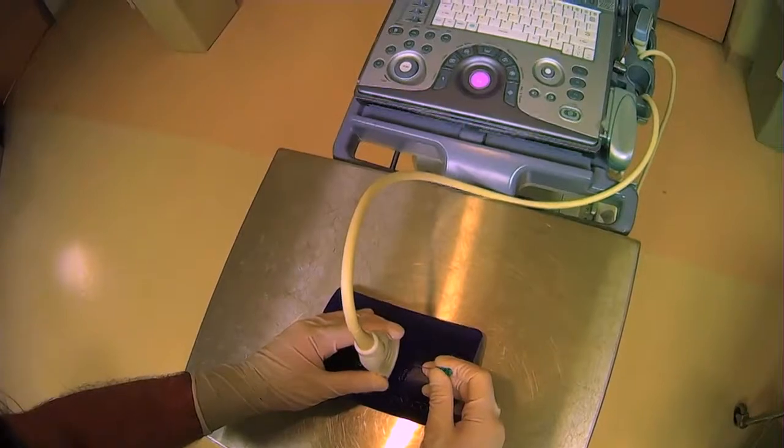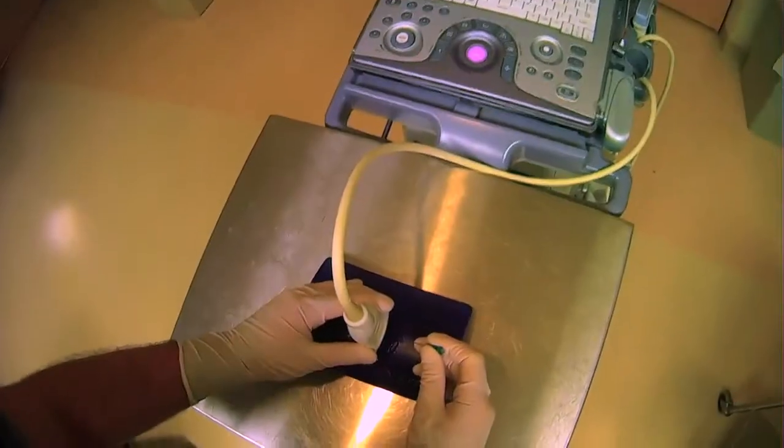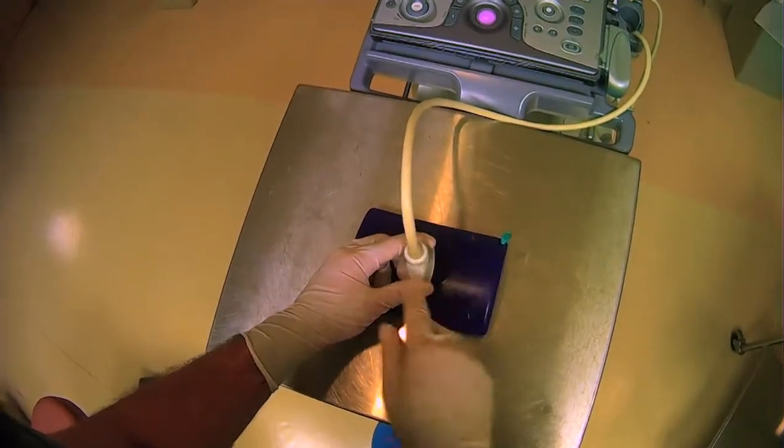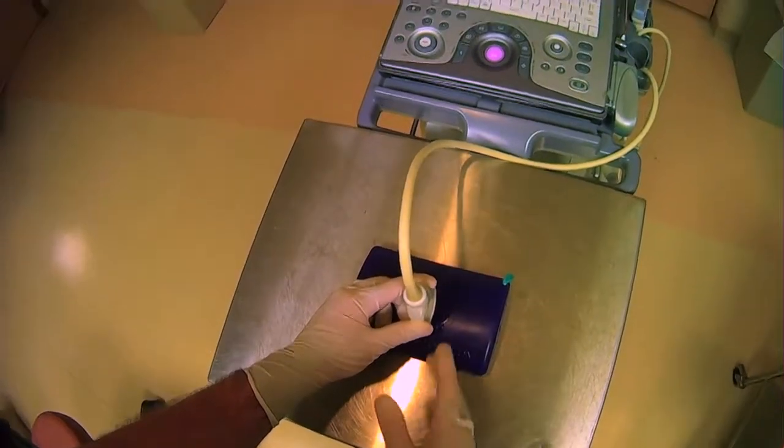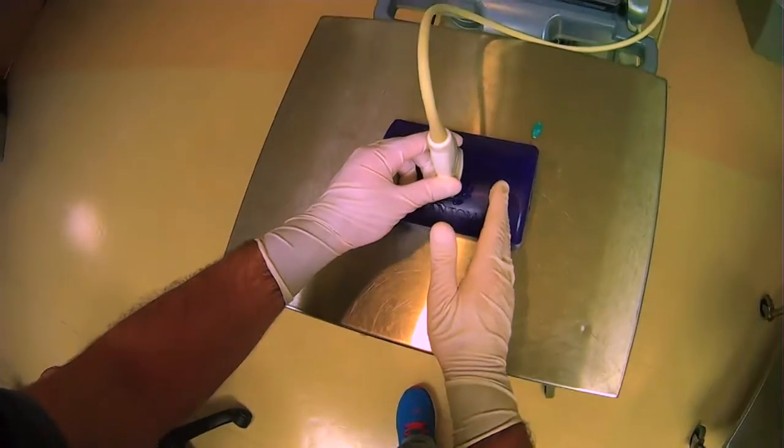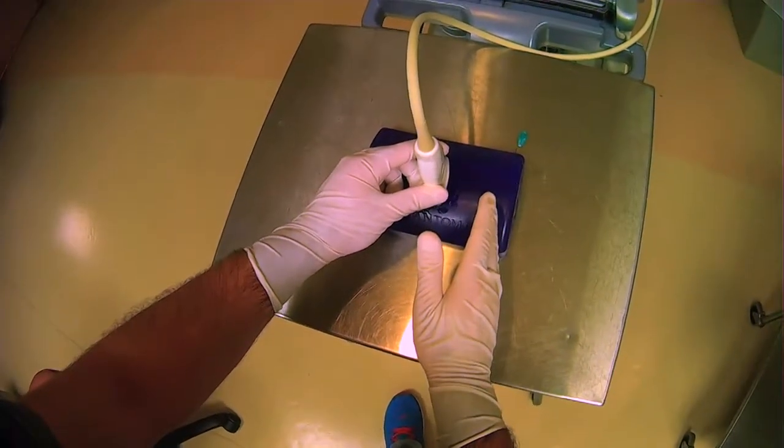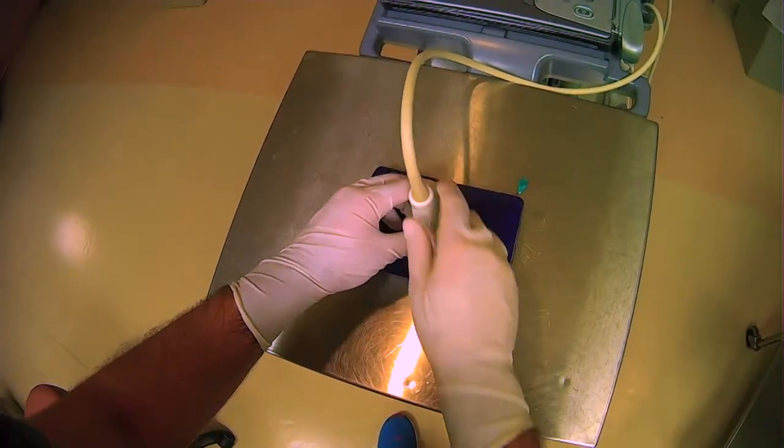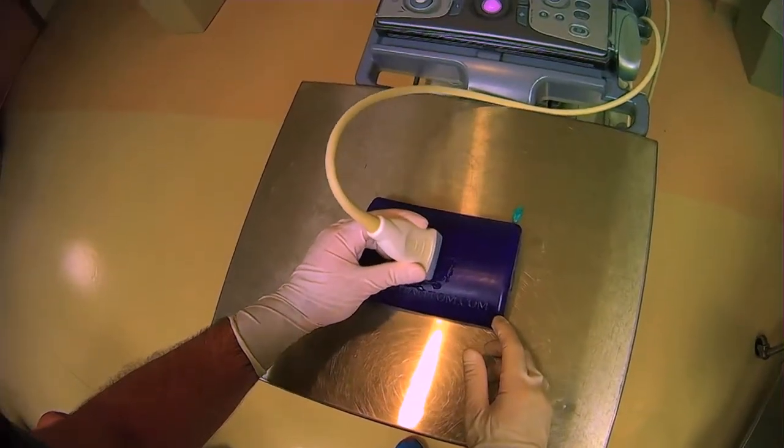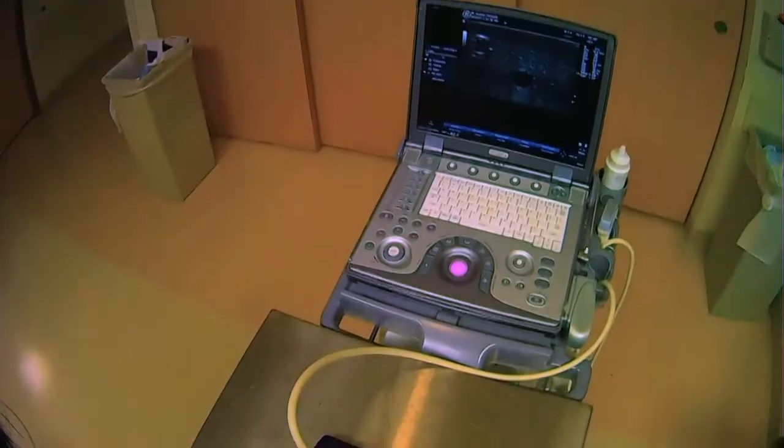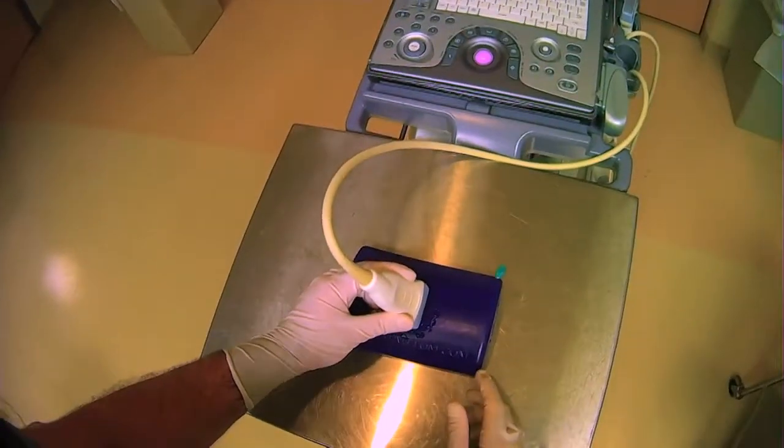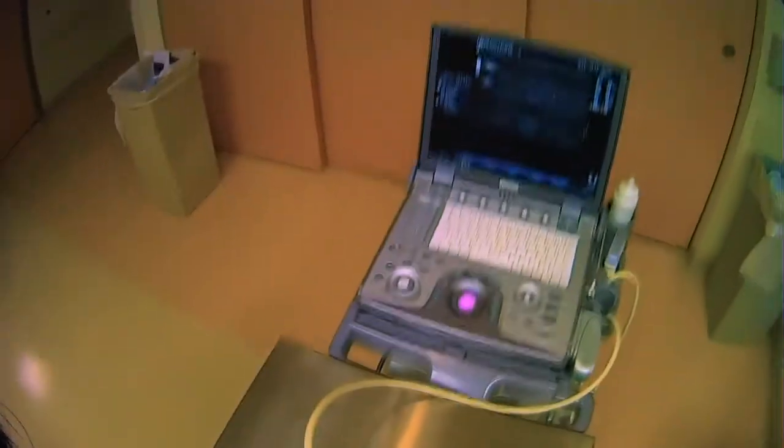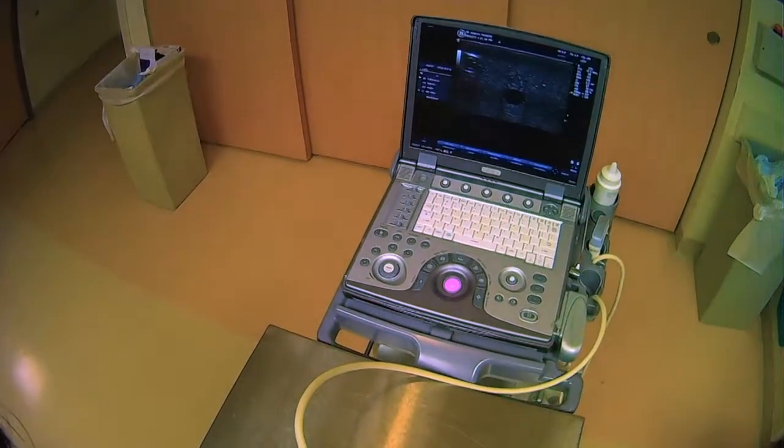So one thing you can do to account for this is that you can actually alter the way that you hold your probe here. Because we're entering on the right side of the probe here we can actually oblique our probe like this so it will take less time for us to see that needle tip once we begin inserting it.